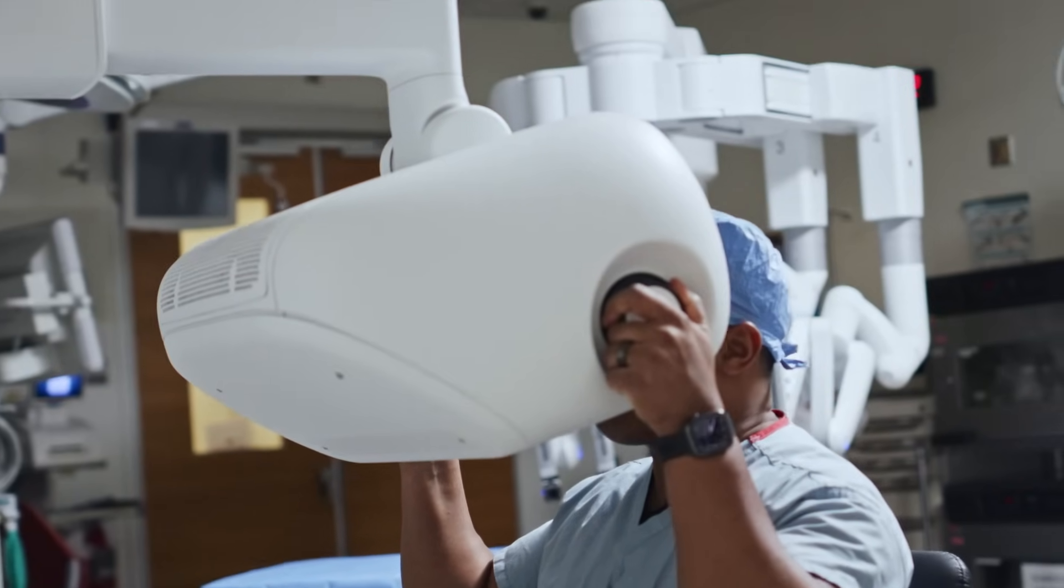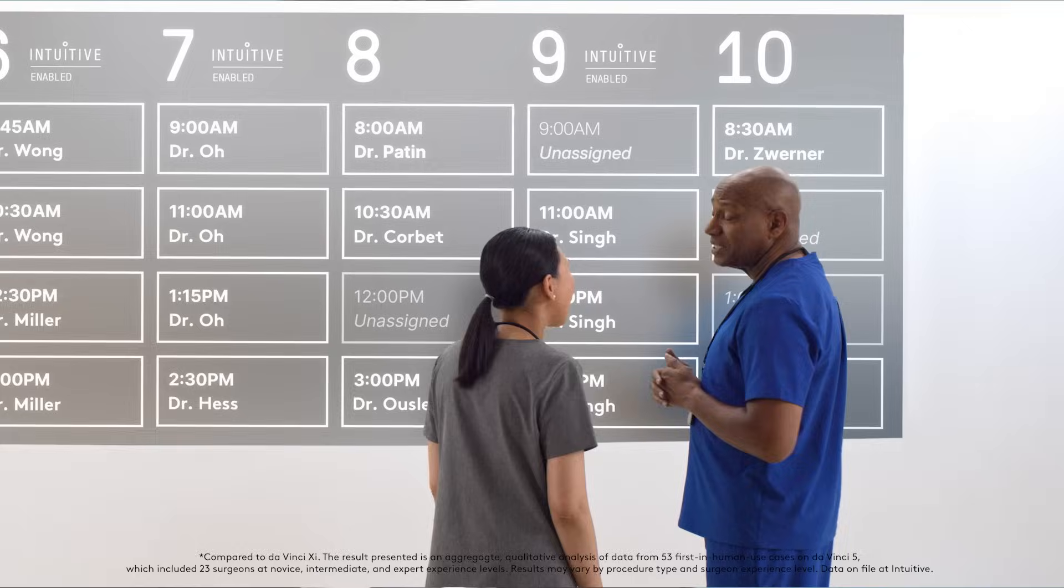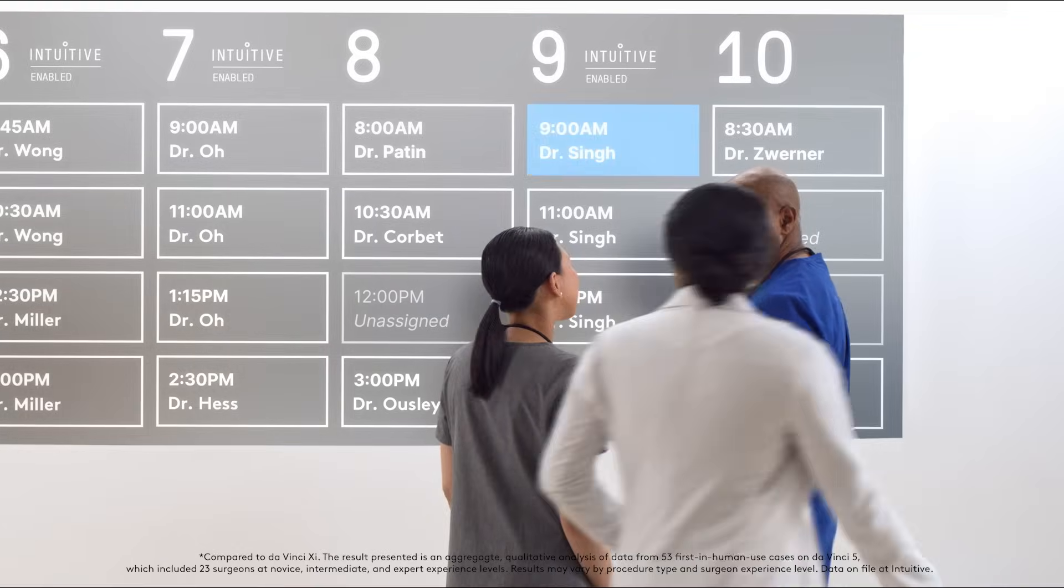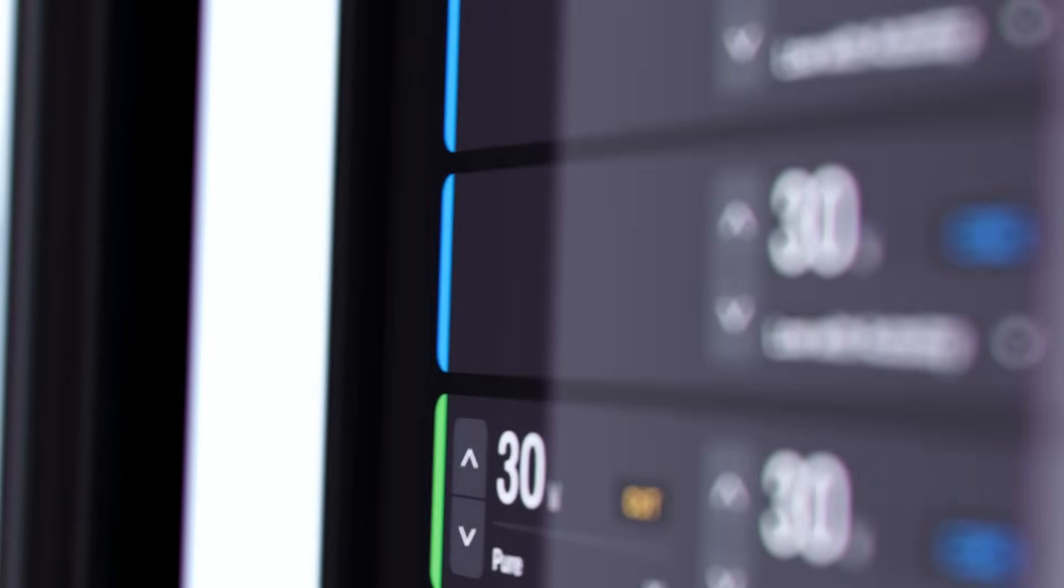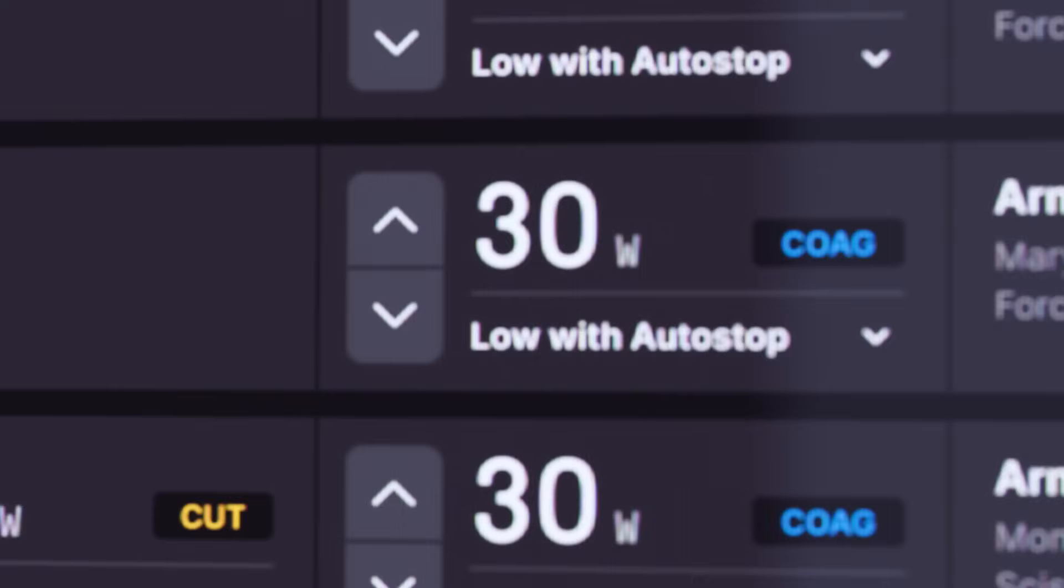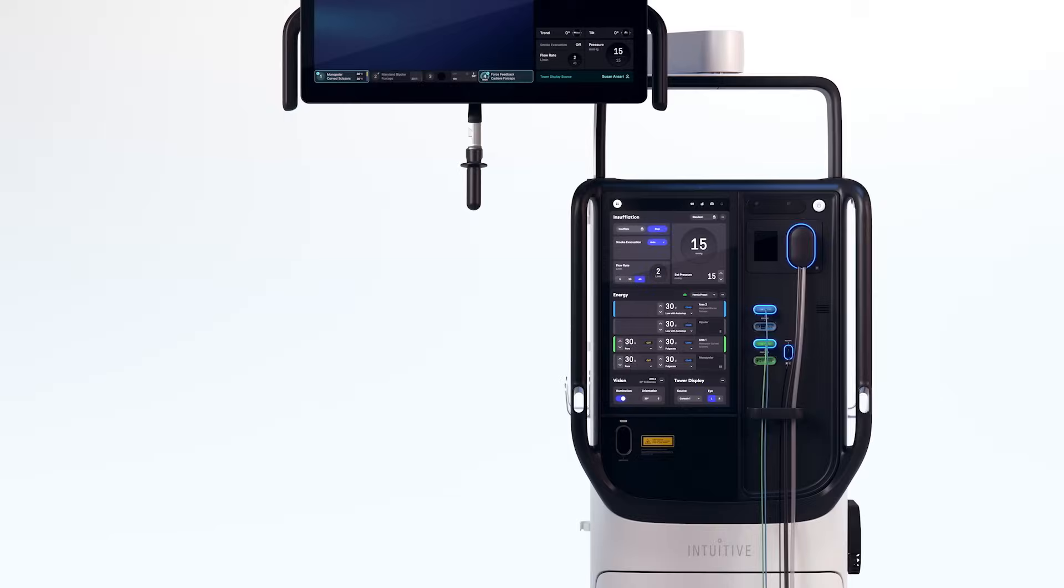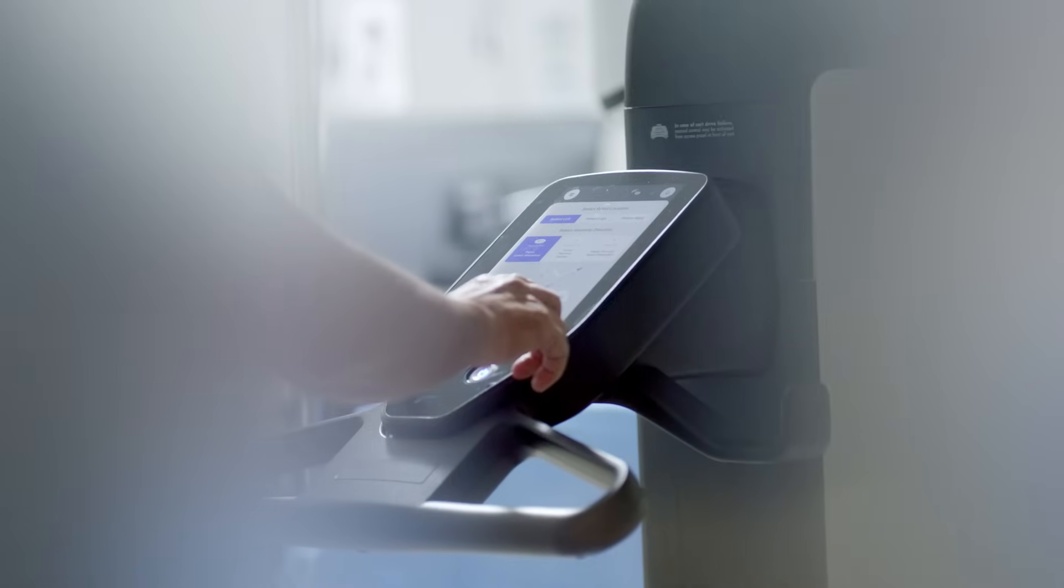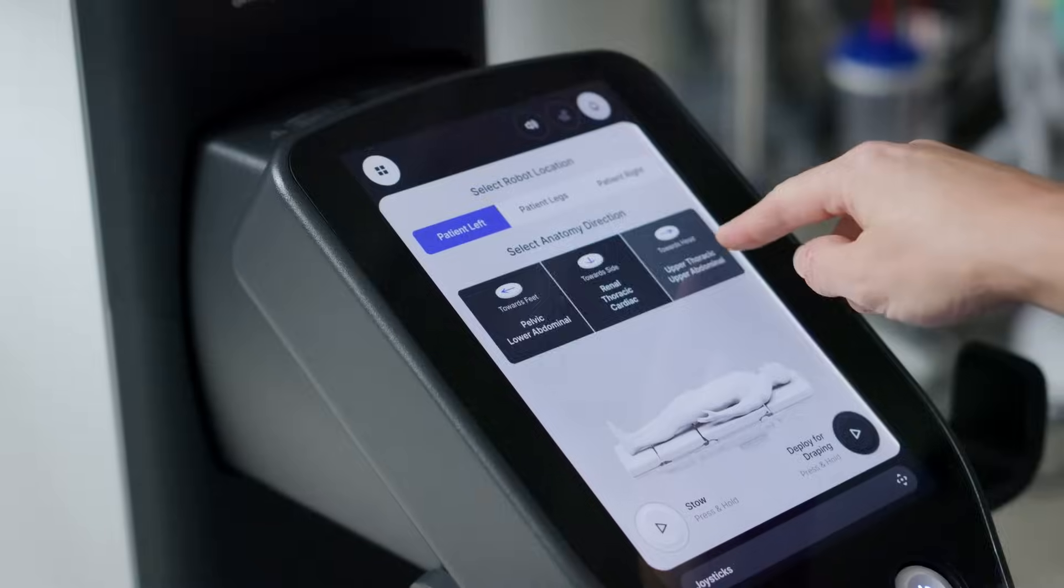We are seeing DaVinci 5's capabilities result in faster surgery which translates to our customers ability to do more surgeries. I think having the integrated new components will make the process of starting the case a lot more efficient.